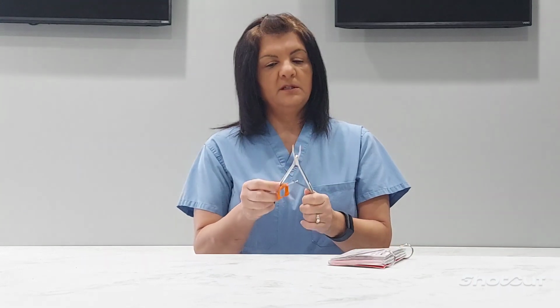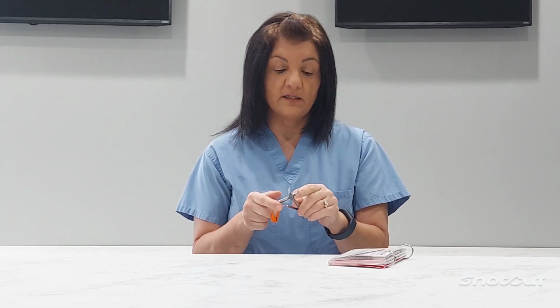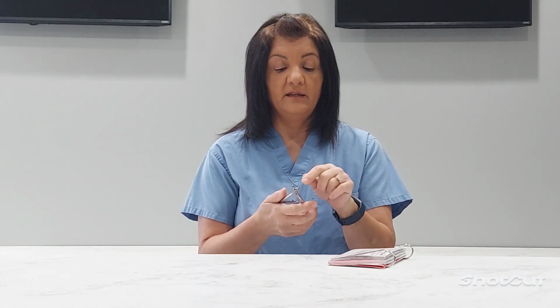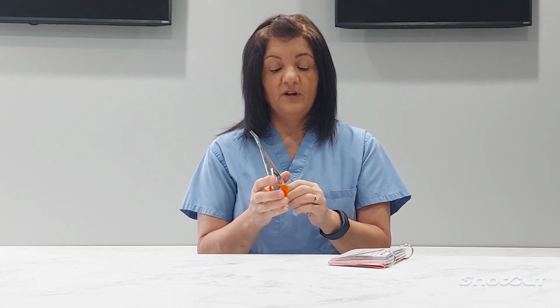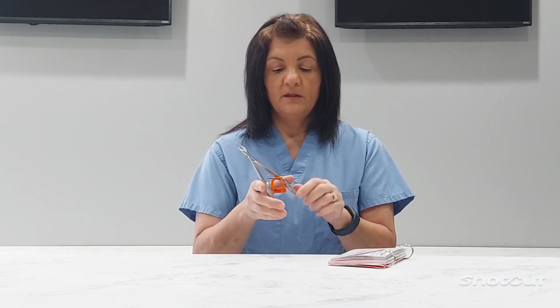So the next item I wanted to talk about is a single action rongeur. Now these are fairly simple instruments. Again, you're checking the lockbox, you're looking for pits, cracks, rust, and stains. This particular one has several cracks. There's a giant crack along the side. There's a crack along the screw. That's a lot of times where you will see cracks on instruments. I'm going to test for function. One of the things that we're looking for too is for rust around these screws.